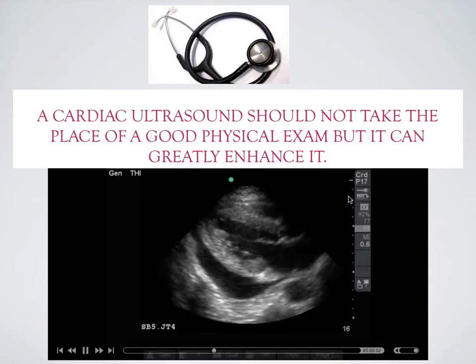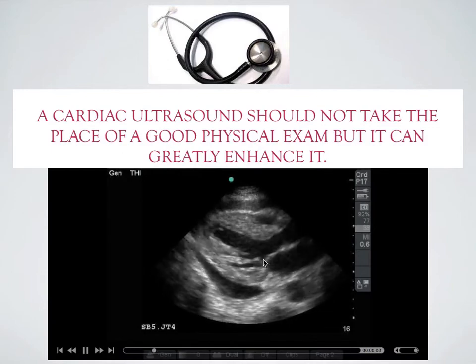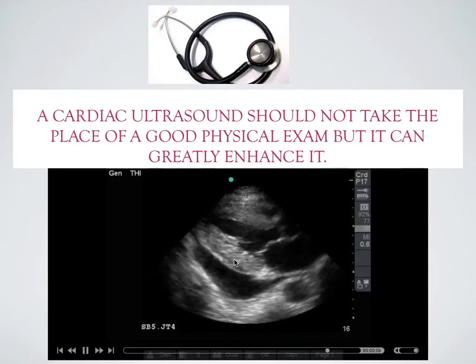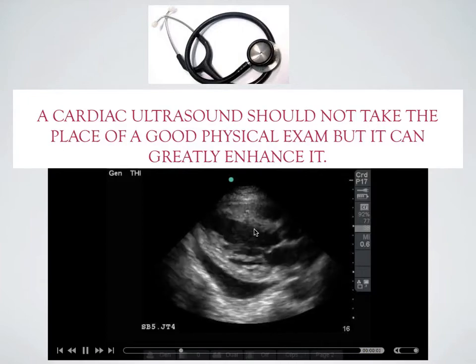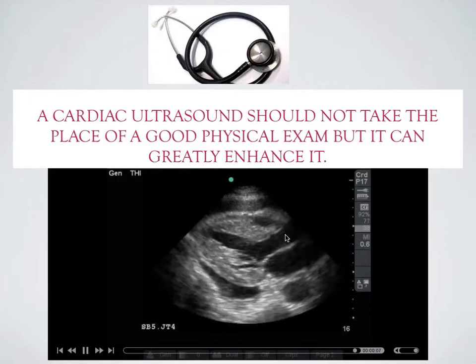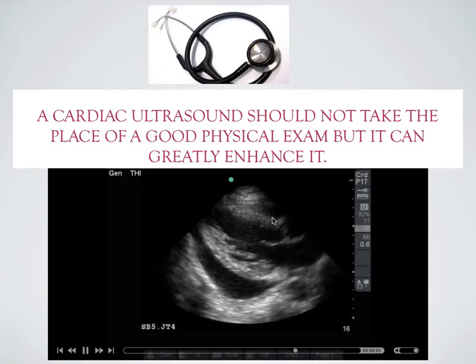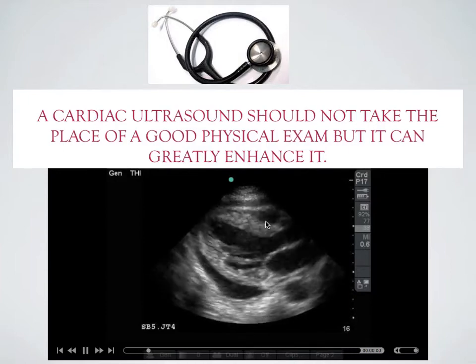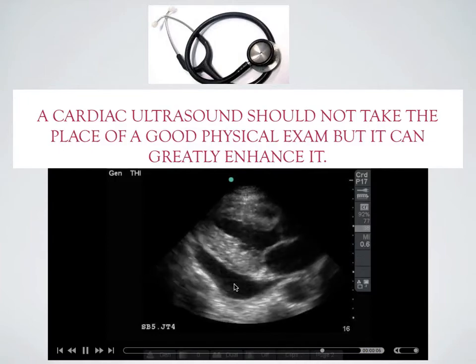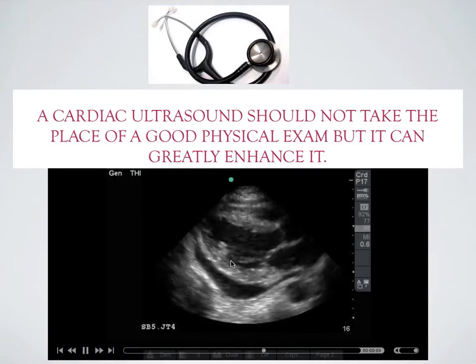So, for example, in this image, we can see at the arrow, the left atrium, the mitral valve opening and closing. Over here are the walls of the left ventricle, this being the septum. The blood flows from the atrium into the ventricle, gets pumped out the aorta, where we pass by the valves over here, the aortic valve. Just anterior is the right ventricle, and surrounding the entire heart in the pericardial sac is a fairly large pericardial effusion. And in fact, you can see the swinging of the heart that creates electrical alternans.